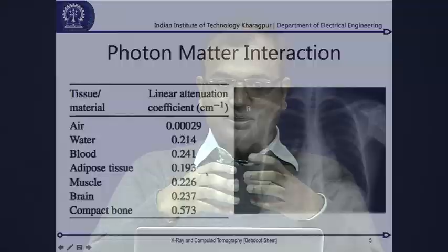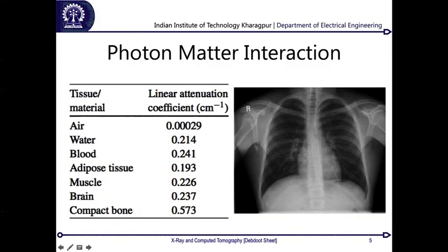Although you have a lower attenuation coefficient, the total length the X-ray has to traverse, which is the width of your body, matters. If you are a very healthy person, you have a much wider width to be covered, so your total attenuation there is high. That's why whatever attenuation you see for the bones, say the rib cage, arm bones and collar bones, the same attenuation is reflected here. So from one projection X-ray you can never make out whether this is a bone or some other structure, until you have a very good understanding of the anatomy. Just looking at the grayscale intensities, it is not possible.